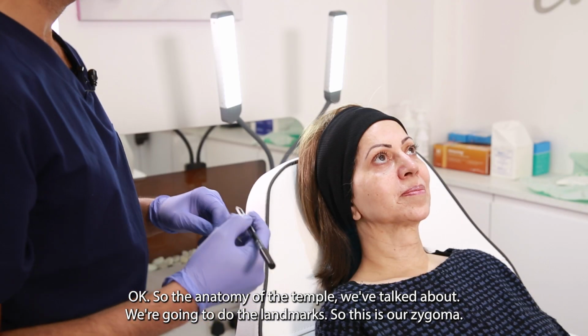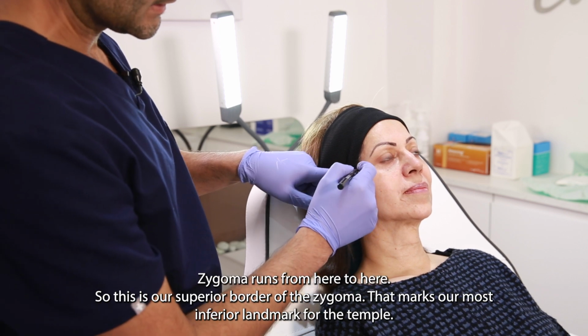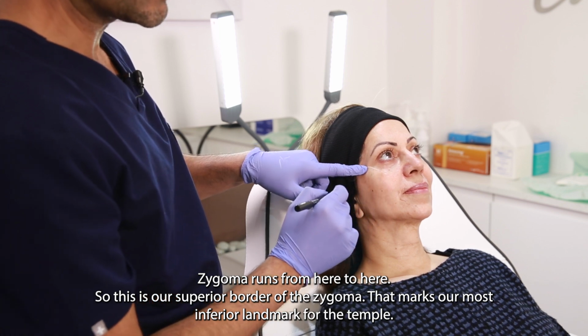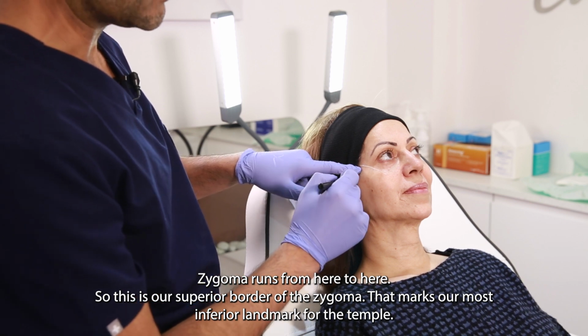Okay, so the anatomy of the temple we've talked about. We're going to do the landmark. So this is our zygoma. Our zygoma runs from here to here. So this is our superior border of the zygoma. That marks our most inferior landmark for the temple.